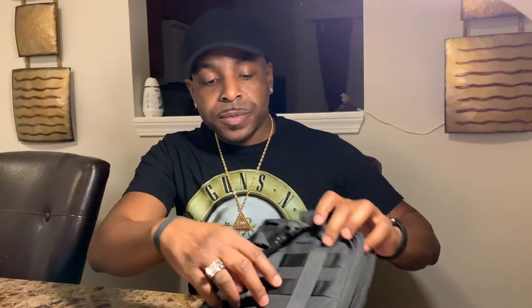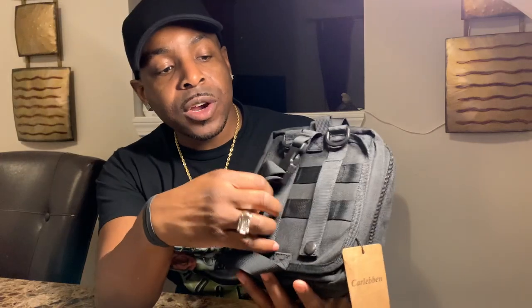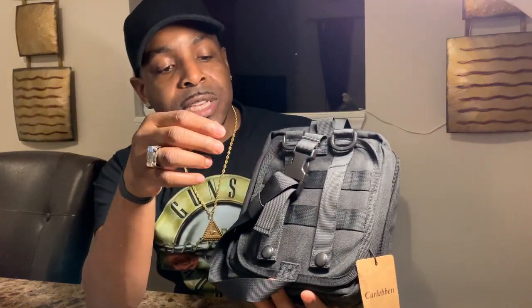Here on the back you have the MOLLE straps. One thing I don't like about this is that it's a rip-away bag. That's cool for emergencies, but when I have it on my battle belt and sit down, it starts to rip away automatically — it just doesn't stay attached to the bag.